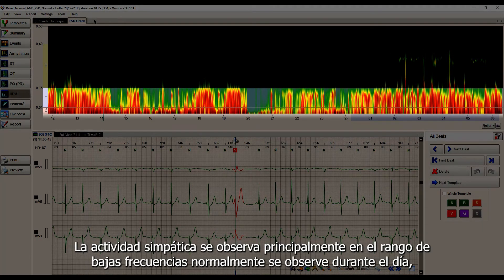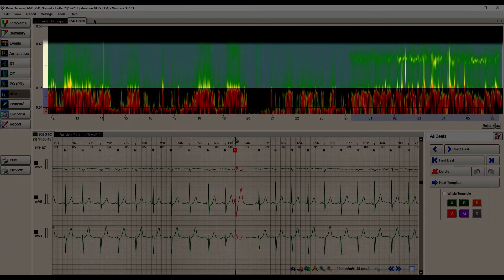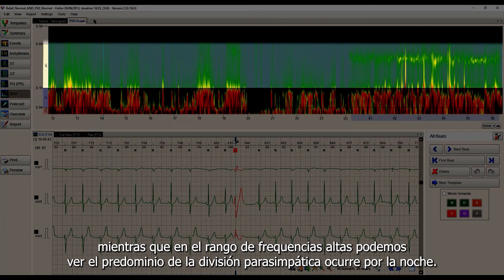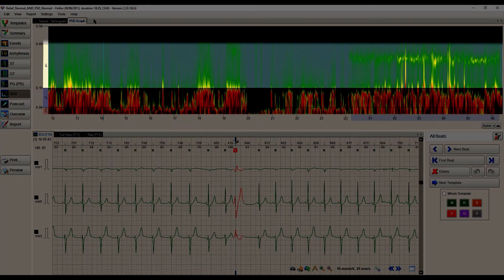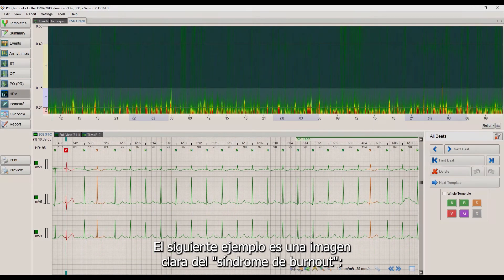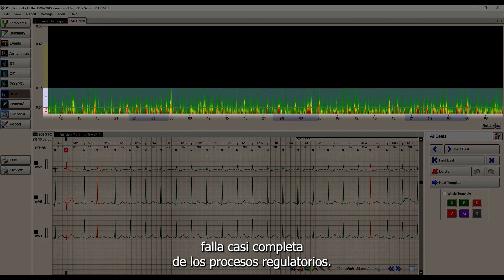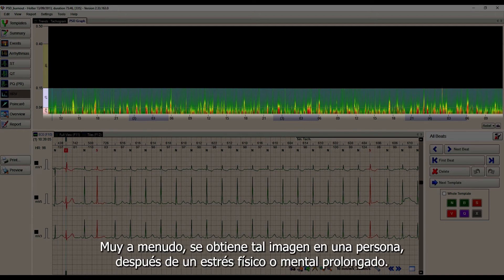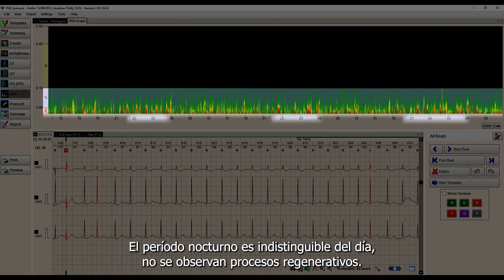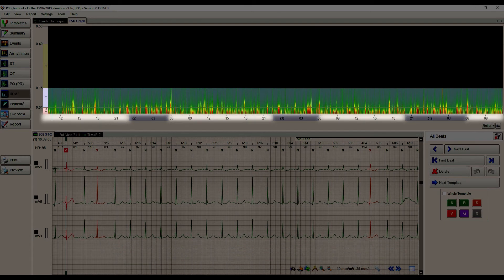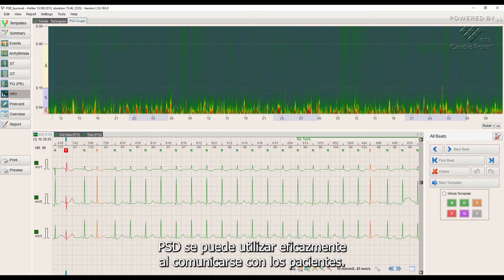Sympathetic activity is mainly observed in the low frequency range and it normally should be seen during the day, while in the high frequency range we can see the dominance of the parasympathetic division that occurs at night. The next example is a clear picture of burnout syndrome — almost complete failure of regulatory processes. Most often we see such a picture in a person after prolonged physical or mental stress, where the night period is indistinguishable from the daytime and regenerative processes are not observed.